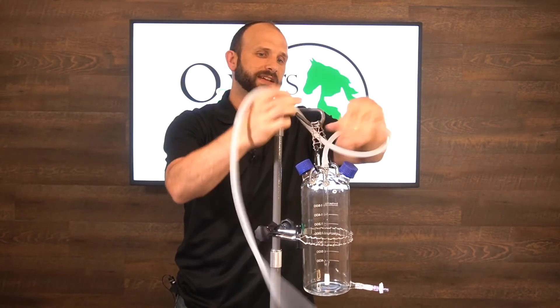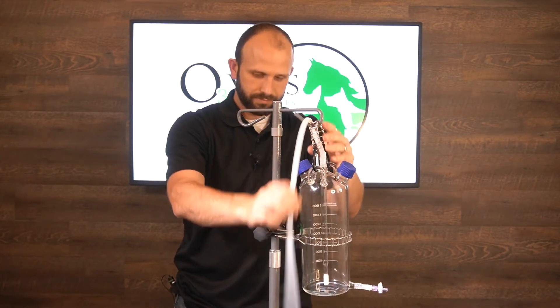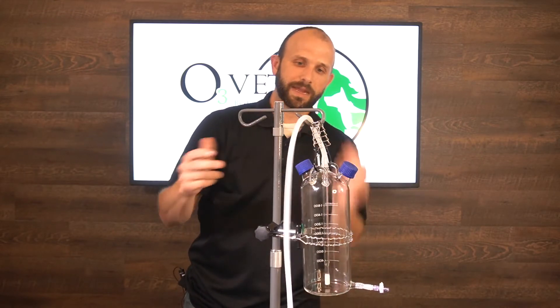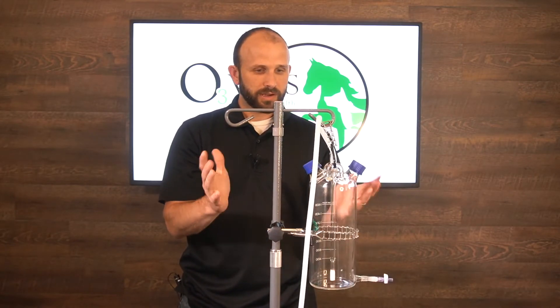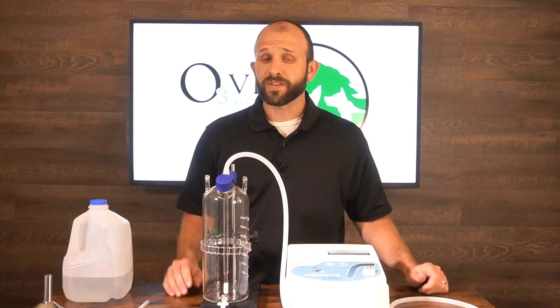Run the tubing up through one of the hooks so it doesn't kink and stays out of your way. That's the setup for your bubbler on an IV pole — that's all there is to it.